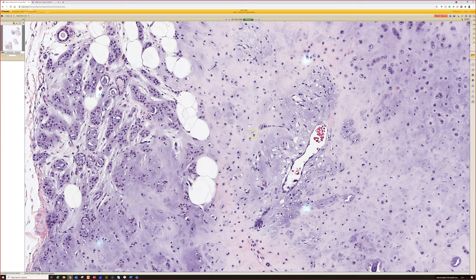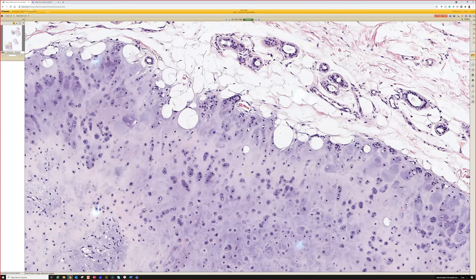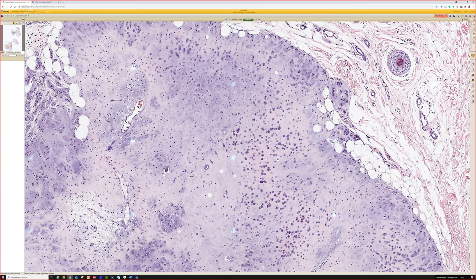Mixed tumors are mixed because they're a mixture of epithelial and myoepithelial cells. And the myoepithelial component can take a variety of forms: spindle, plasmacytoid, chondroid. My understanding is that the myoepithelial component is largely responsible for generating the stromal part of the tumor, and then the epithelial component makes the little ducts and tubules. But sometimes those ducts and tubules can be very focal. And I've actually seen mixed tumors with a bunch of weird-looking myoepithelial cells get misdiagnosed as melanoma and other things because the person overlooked the very focal ducts.